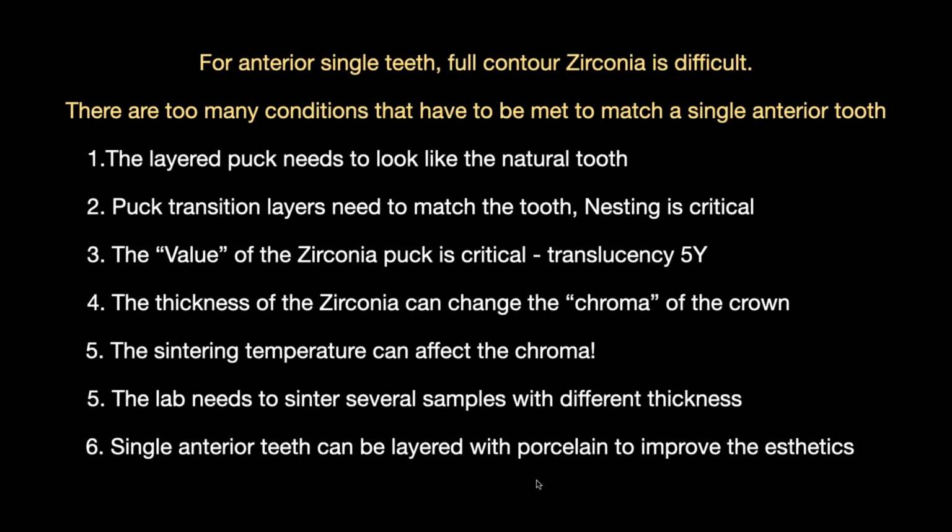The puck transition layers need to, this nesting, I'm not too versed on this, but I get on Team Viewer and I sort of try to tell them, okay, I need this, I need that. And to me, it's a lot easier to build up a nice little framework and layer it. You can control the aesthetics a lot more. So the value, quote unquote, of the zirconia puck is critical.